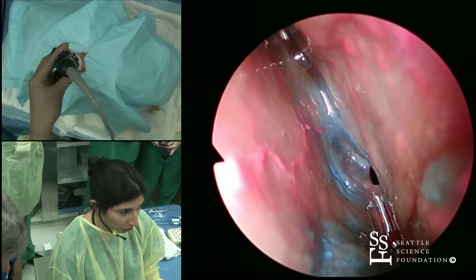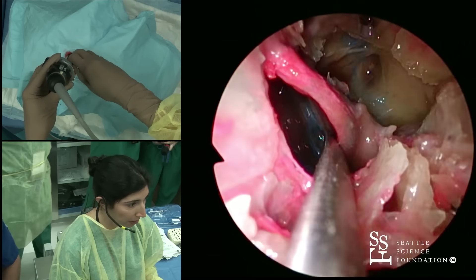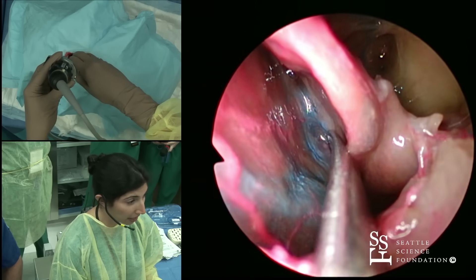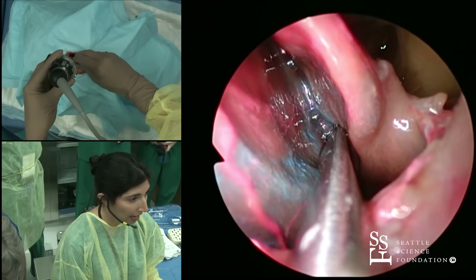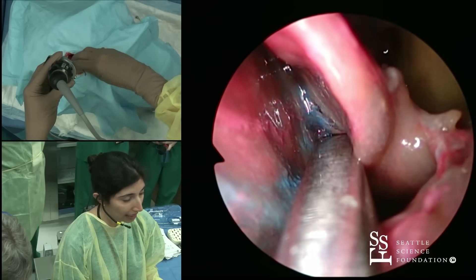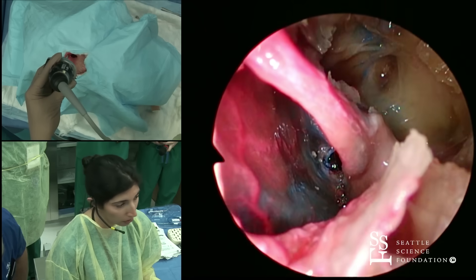You can see the sphenoid ostium right there. Like I mentioned before, if you look at where the roof of our maxillary sinus is, that's exactly where I went as far as superior to inferior direction, and that's exactly where our sphenoid ostium is. It's a very good landmark — a very good way to see exactly where you should be. Now I'm going to use that freer and just widen that a little bit. The point of widening it is really twofold: it makes it much more clear as to where that is, if it's a little pinpoint or if you have any mucosal swelling around it.